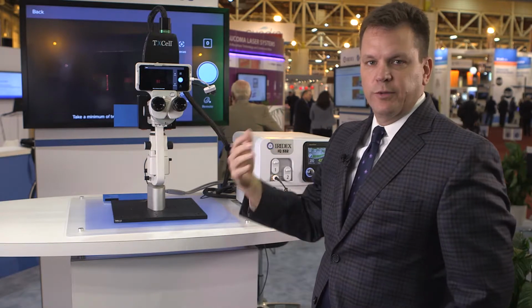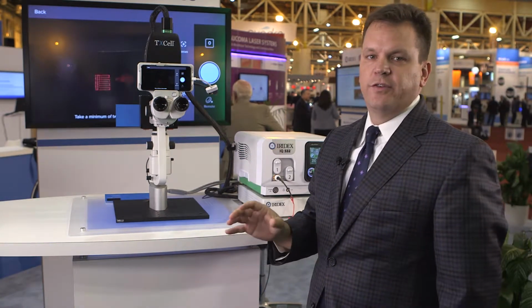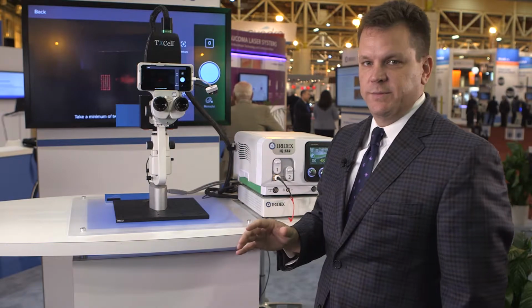On that particular screen there before, you can put in duration, the number of milliseconds that you're going to use the laser for, the power of the laser, and all kinds of treatment information, so you'll have it for a future record of your EHR system as well.